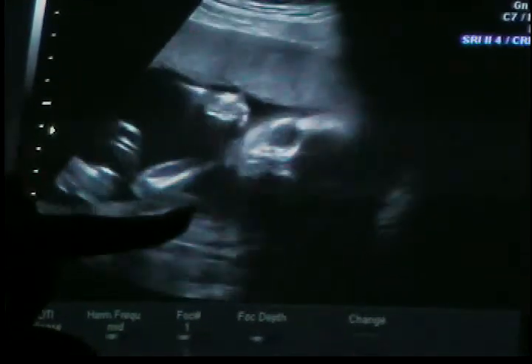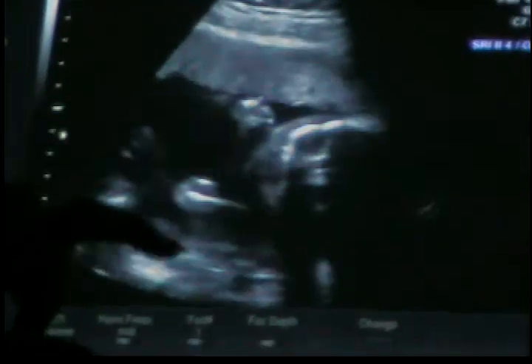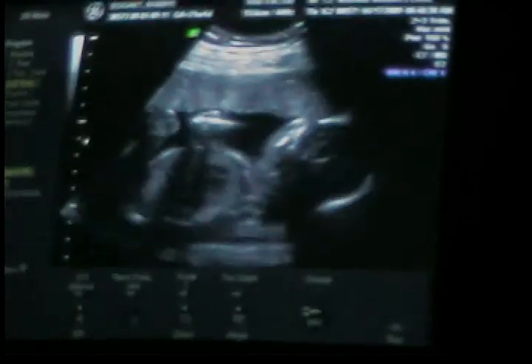To hear the heartbeat, he's been having to go all the way down to my bladder because he's been chilling way down low. Yeah, the head's down low. There's a hand up by the face. Eye, nose, kind of the mouth area coming in. And our other little arm. And then I'm going to turn real quick. Flip between legs.